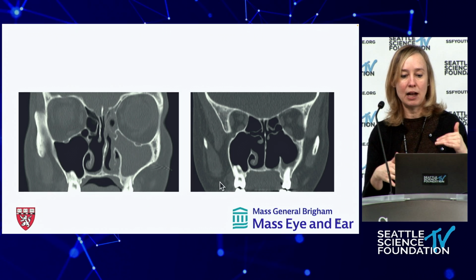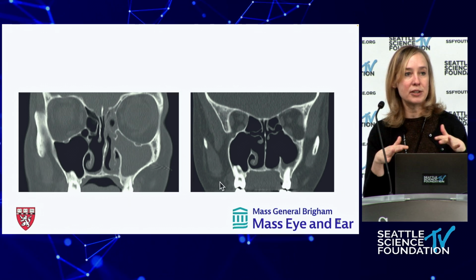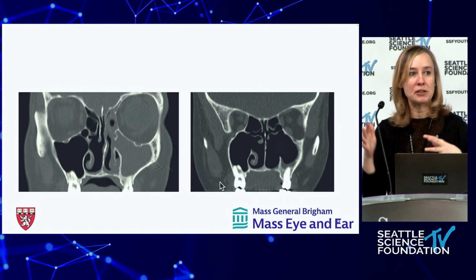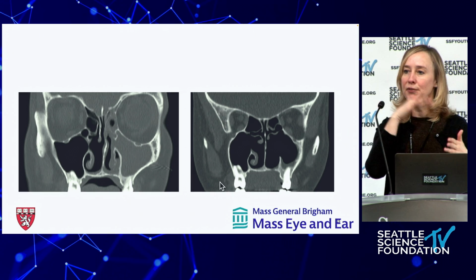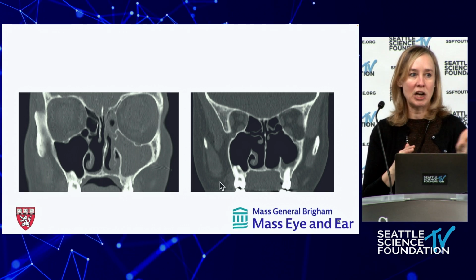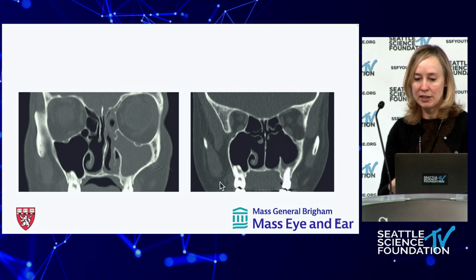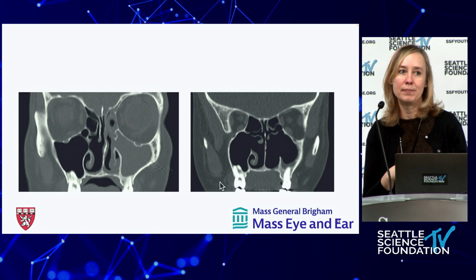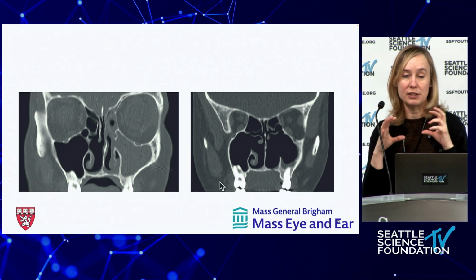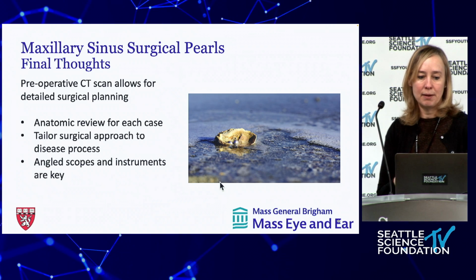So one, it really helps as far as being able to monitor the inside of the sinus. The other is with irrigations, especially in someone who doesn't have really good mucociliary clearance. The rinse from the opposite nostril basically washes into that maxillary sinus very effectively and is able to clear things as well. So it's actually very easy to do this, and it really is very helpful for select patients. So with that, I'm going to go ahead and complete.